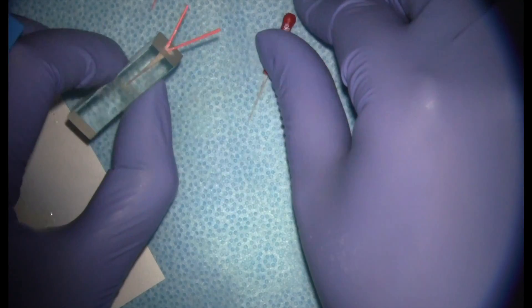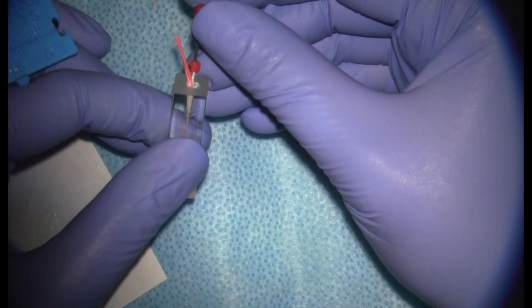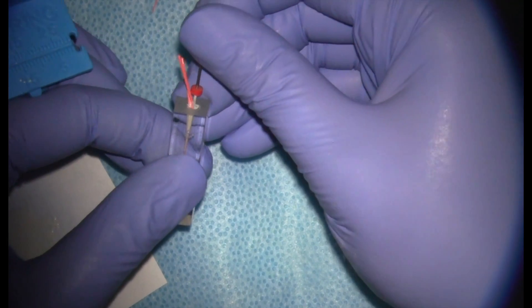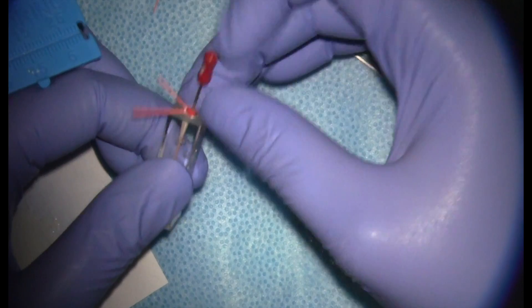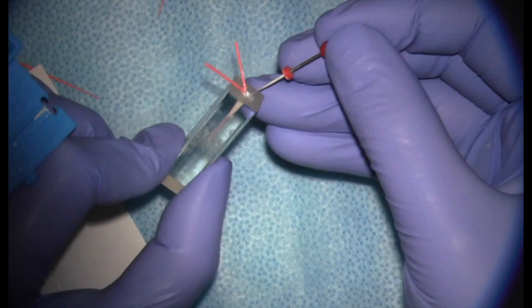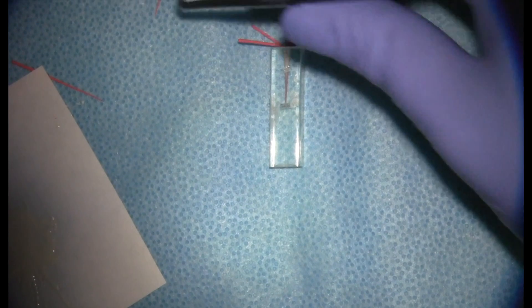Now that I have my first accessory point in, I'm going to place my spreader back in alongside my points in the same area as before. If you're going from the mesial, always keep going from the mesial — or distal, same thing — so you're pushing all the cones in one direction as you go. I'll use gentle apical pressure to work the spreader down alongside those cones, move the stopper to my reference point, and measure how far it goes. We're going to 13 millimeters now, so I'll hold that spot and measure another medium fine accessory point to 13 millimeters.